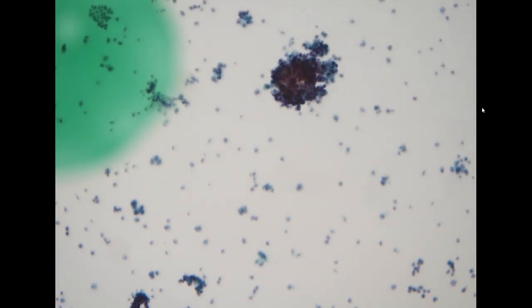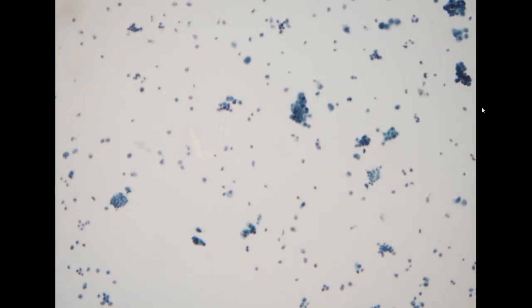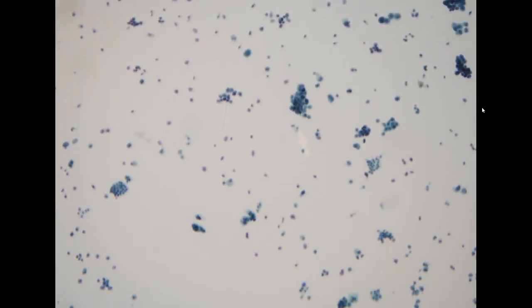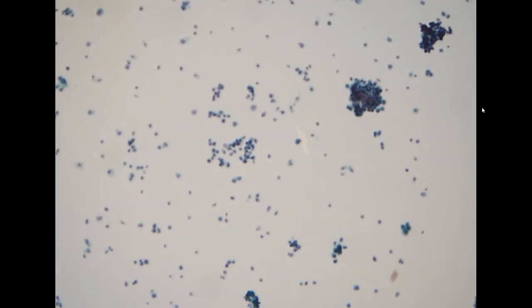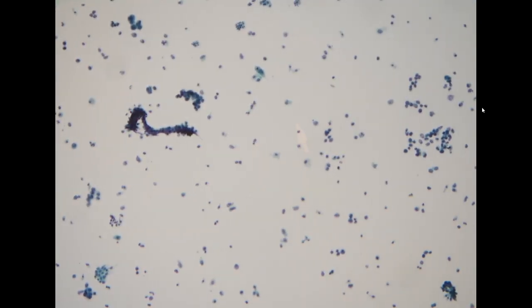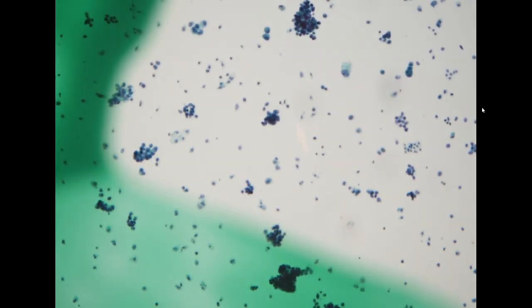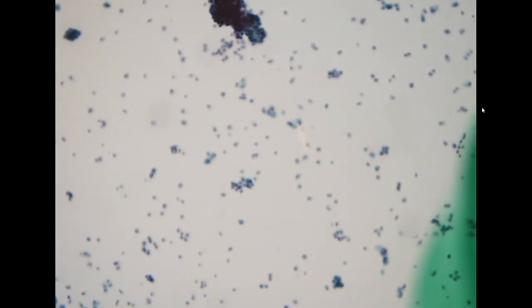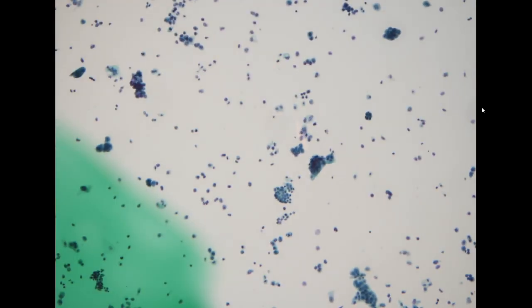Because it is a washing cytology, we know it is very common that we will see cohesive larger fragments of urothelial cell. This type of specimen is problematic because you still need to go to the higher power to check the detail of the cytomorphology.